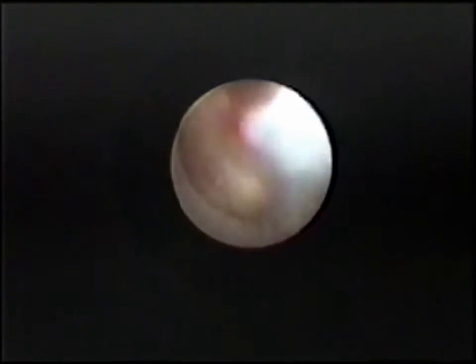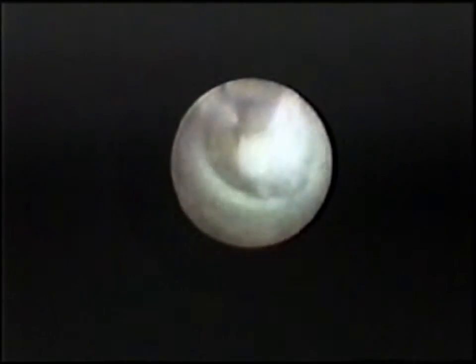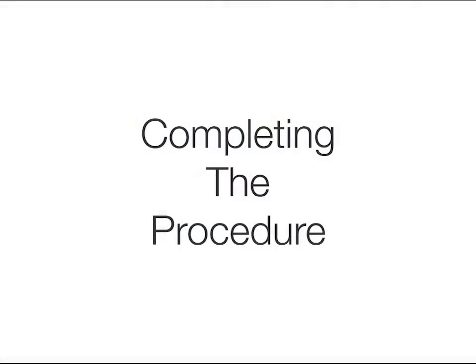Withdrawing for the last time, you see the working channel walls, and outside the body, you see the jet of irrigate. Withdraw the working channel. Some doctors inject an antibiotic into the disc and the tract through the working channel as they withdraw. Close the wound. Using an oversized dressing will help remind the patient that, no matter how good they feel, they have just undergone a discectomy.